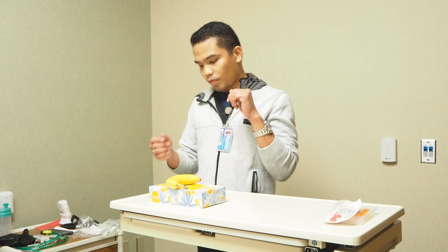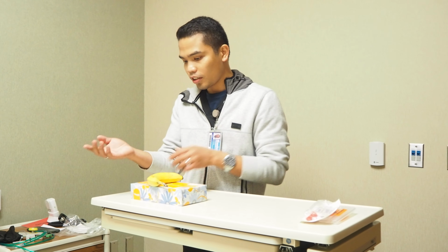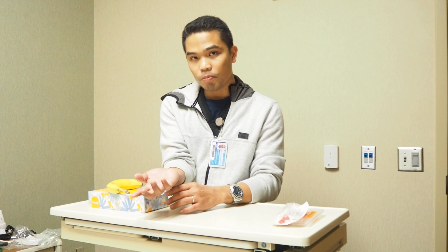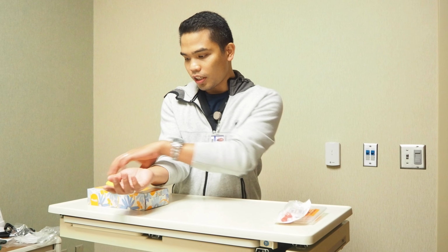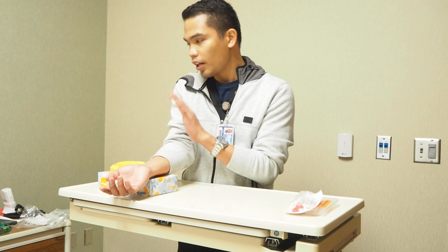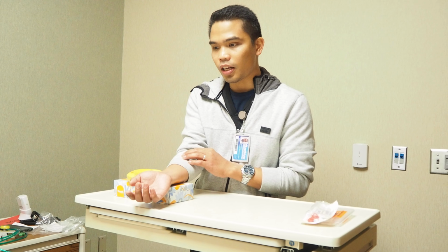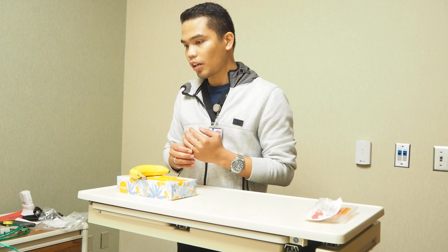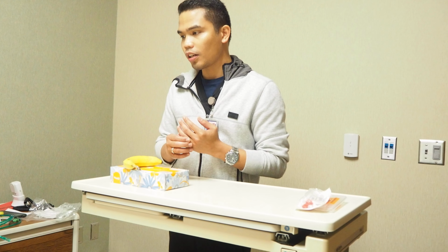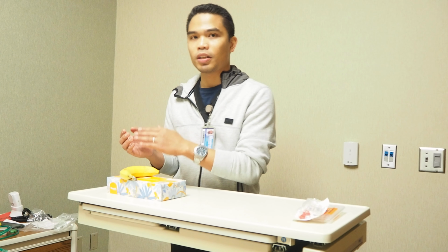So for you to know, I'm going to let you rest your hand on a roll of towel or even a tissue paper. I'm going to extend the patient's hand, do it like this, and also let the patient know that they just have to be comfortable and relax. Another thing is I have to check which is the patient's dominant arm, so that I will obtain the blood gas from the non-dominant arm.